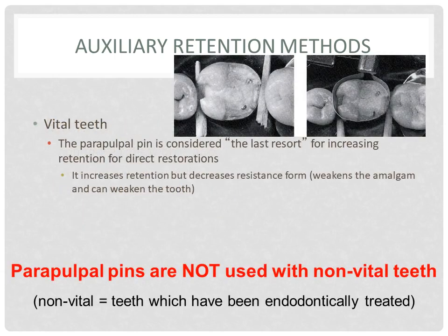Of these methods, the parapulpal pin is considered the last resort. If we have another method for retention, we will use the other methods. Why? Parapulpal pins increase retention but decrease resistance form. Also, the placement can be tricky in some teeth, when minimal tooth structure remains.